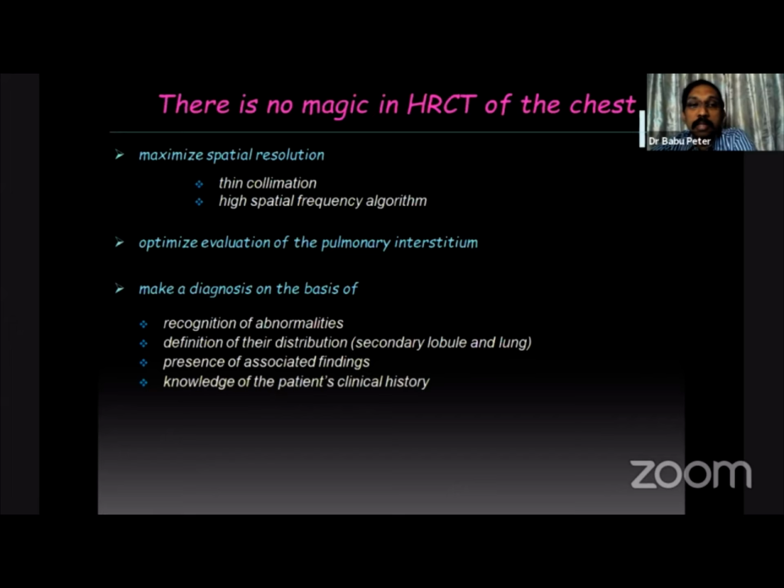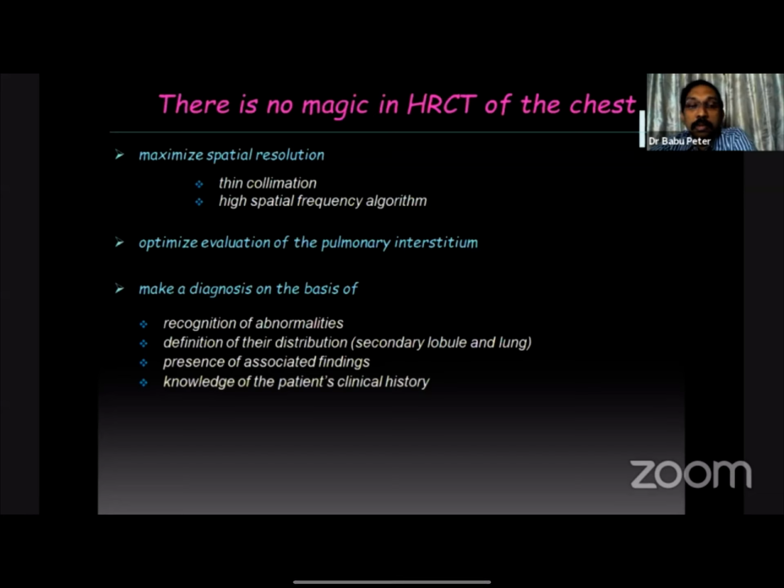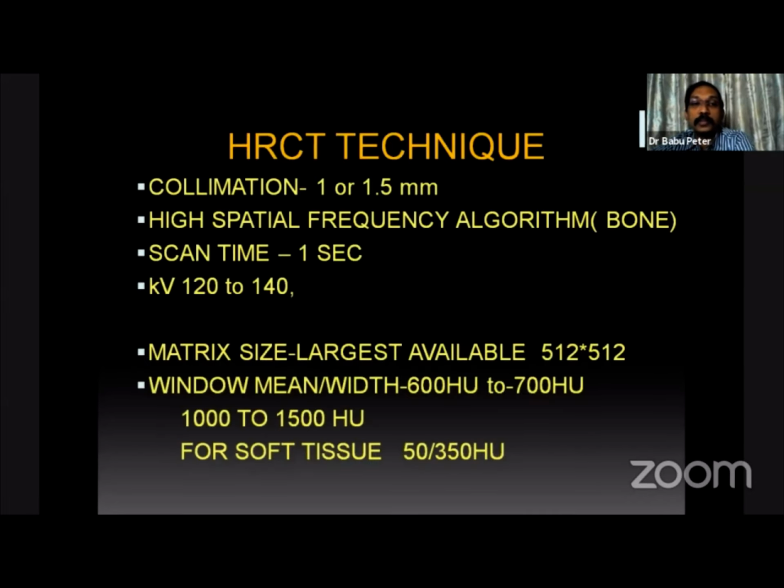And this is very important to evaluate the pulmonary interstitium. Now, what we shall go through is how to make a diagnosis based on recognizing the various patterns, based on the distribution and any associated findings. And most important of all is to have a basic knowledge of the clinical history of the patient.